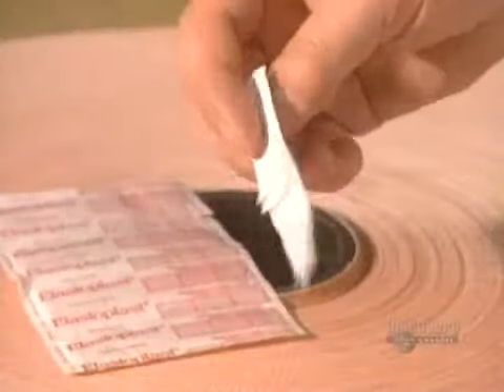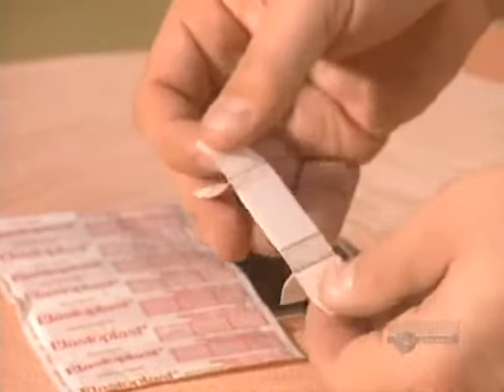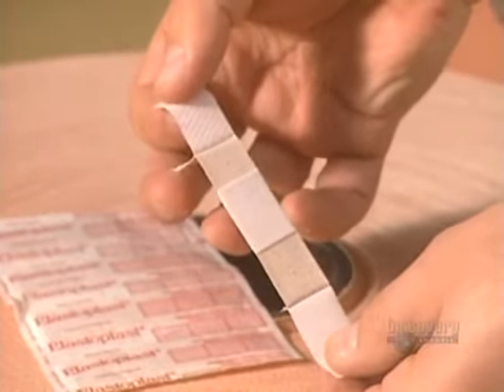Each year, this facility produces a staggering 4 billion bandages in 65 different models.